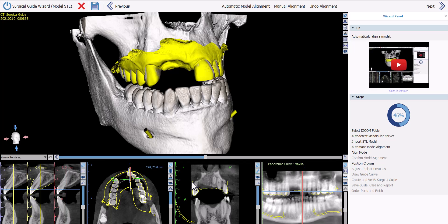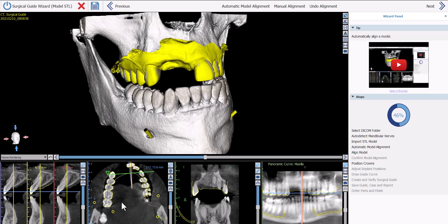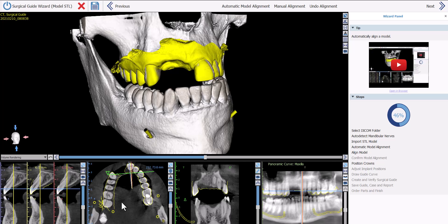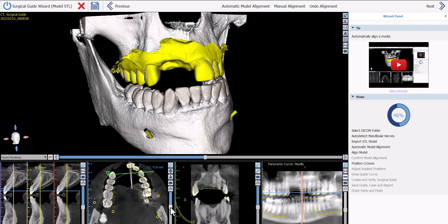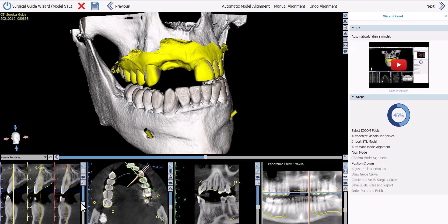We can see the outline of the yellow model in our various 2D views. In the axial view, as we approach the occlusion, the model outline in yellow should be wrapped very tightly around the teeth. Use the mouse wheel to flip through relevant slices, or use the slider to the right of the view. Do the same in vertical slices to confirm alignment around the arch. Once alignment is confirmed, click Next.